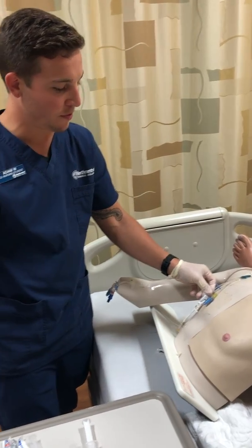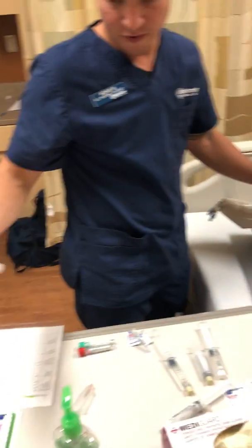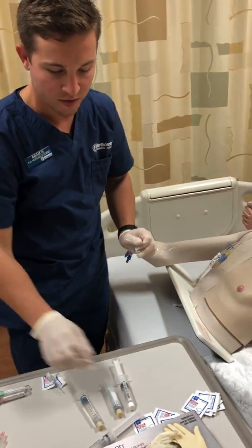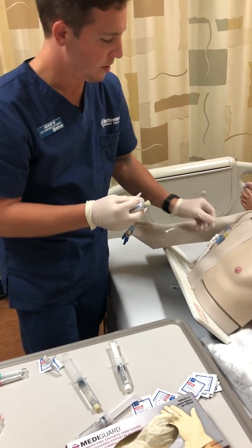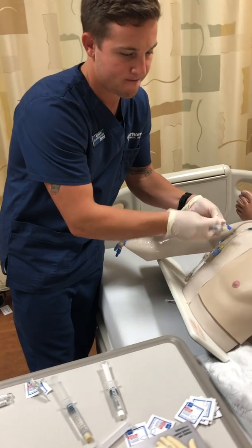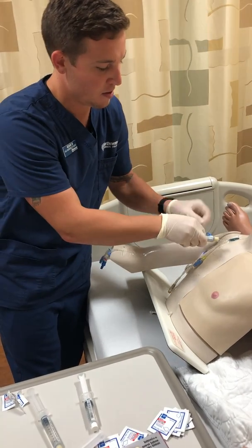I'll throw this away wherever your facility wants to dispose of it, because it's going to have blood in it. Dispose of it wherever the appropriate disposal is for that. Next, this is where we're going to collect our blood. So we have our empty 10 mL syringe and clean, 10 to 30 seconds. We're going to unclamp.